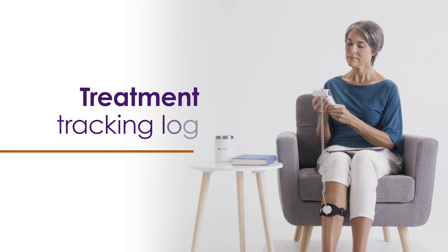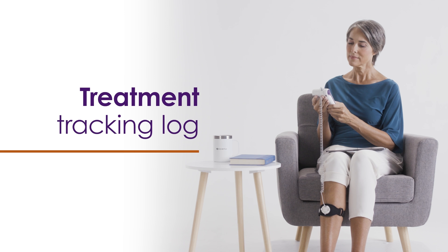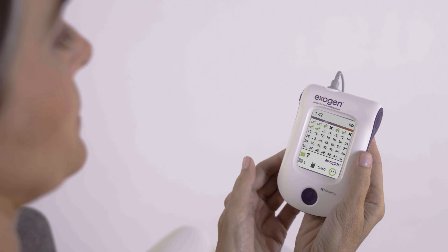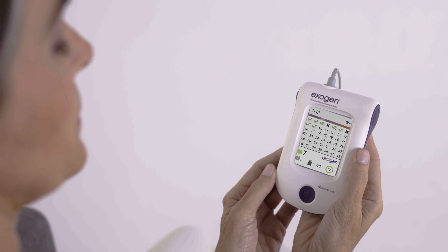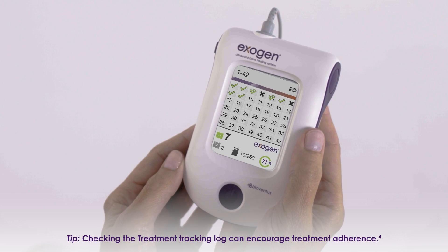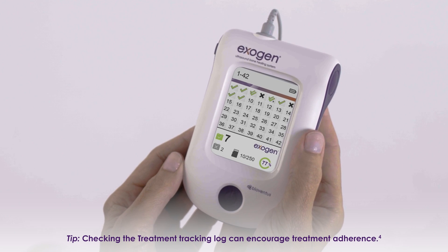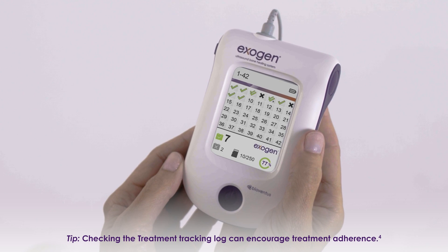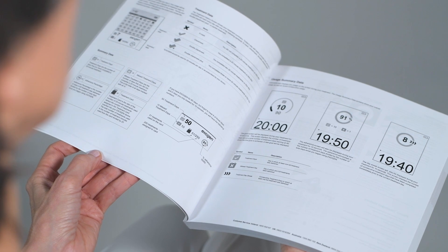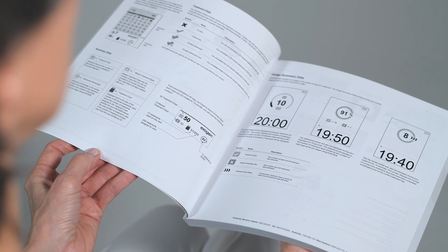Exogen features a built-in treatment tracking log to help you use your device as prescribed. A check mark indicates a day when you completed a 20-minute treatment. An X indicates a day when you did not complete a treatment. Below the log, the treatment summary will display data such as the number of days since you started treatment, the number of missed treatment days, and your treatment adherence percentage. Refer to your Exogen user guide for details about the information on the log screen.